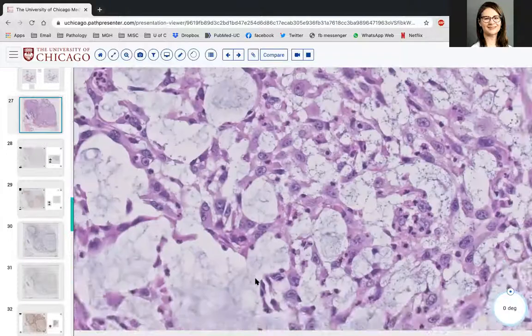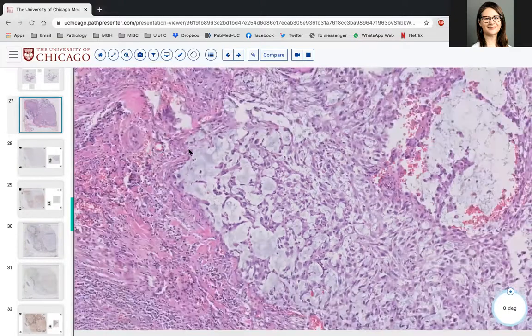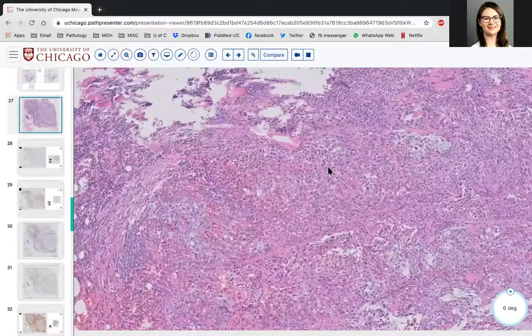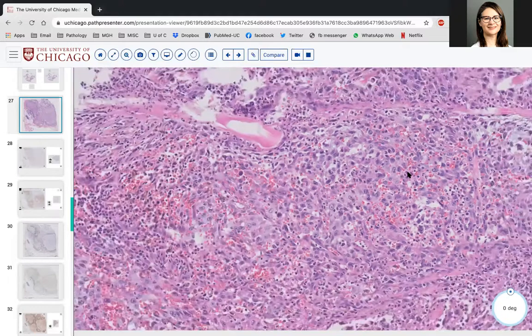Ooh. Big nucleoli. Okay, so prominent nucleoli are also very important in salivary gland neoplasms because you really don't see those in our regular run-of-the-mill benign salivary neoplasms. Once you start seeing prominent nucleoli, you're thinking about malignant transformation or already malignant.